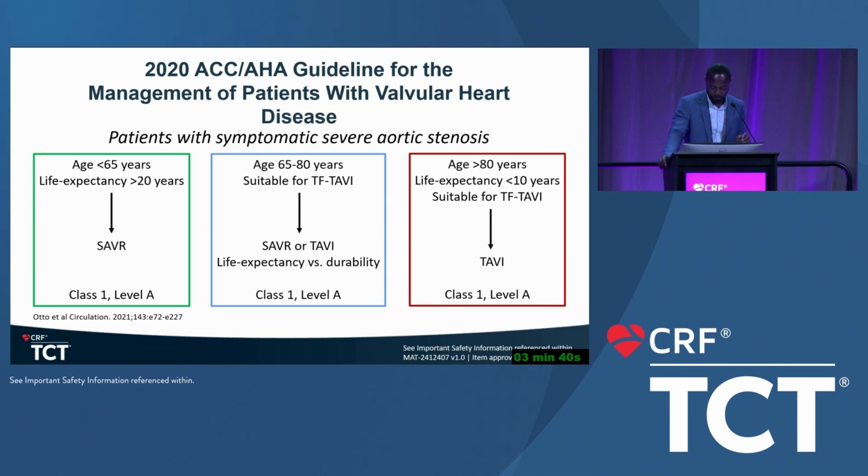I really don't. I'm a heart surgeon. I don't care about coronary access. And honestly, I hear talks from cardiologists all the time. We don't even cath a lot of our patients anymore because we're not as concerned. We're going to treat the aortic stenosis and not worry about the coronary disease on the front end. But a lot of these patients don't ever develop coronary disease. We're talking a lot about coronary access, and a lot of these patients never develop coronary disease.